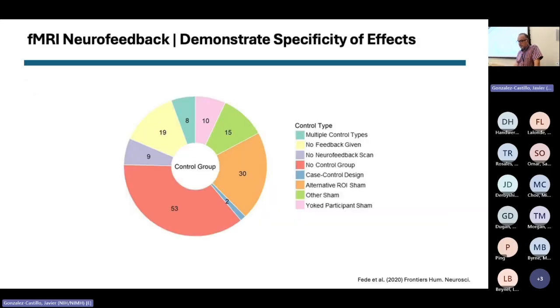which is also a problem because, as I will show, it seems that the neurofeedback effects are not strongest right after the neurofeedback. They tend to increase over time. From all these pilot-size studies, it seems very important to have follow-up sessions several weeks after, not just a couple of days, which again makes those studies more difficult.